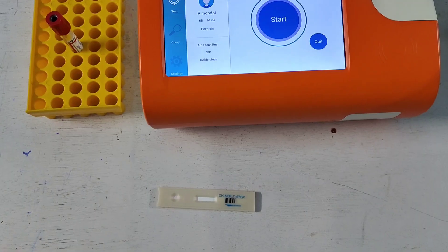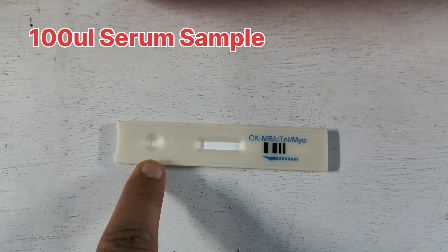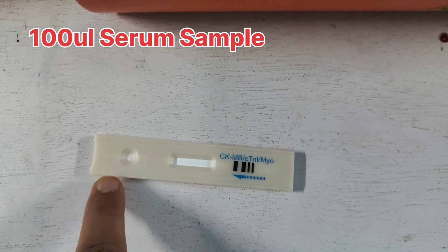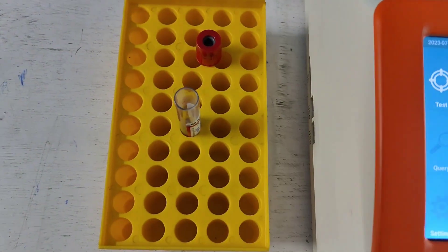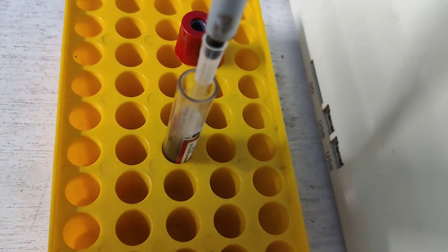Now I am going to open the kit for further procedure. You can easily see the kit here. I am going to transfer 100 microlitres of sample. This is the serum sample and I am going to transfer 100 microlitres of serum sample into the kit.